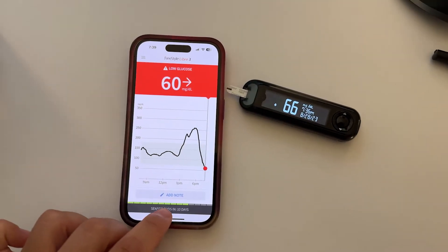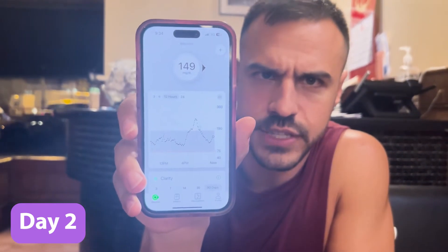Let's talk accuracy. I wore the Dexcom G7 side-by-side with the Libre 3, and I found that accuracy was very good. I would test myself with a glucometer and the numbers were very on par. Two days in, my numbers with the Libre 3 were pretty consistent with what I'm seeing on Dexcom. The Libre 3 said 138 and the Dexcom G7 said 149.